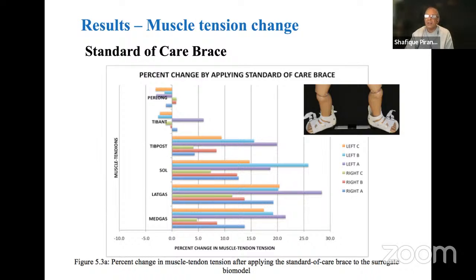If we don't do this, the posterior medial rotator fibrosis will come back because we haven't fixed it. We have to wait for it to go away over time. Now, why am I showing you this particular picture? Because people say, well, this brace is too hard.